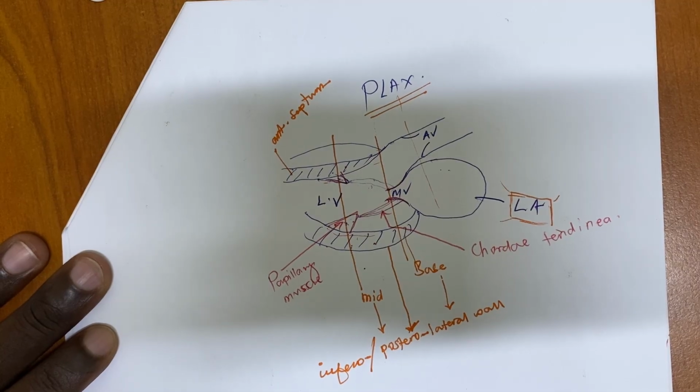Now, from short axis, we went to other views, and we see which walls of the left ventricle we see. Again, remember I told you we don't focus on the right ventricle because it's not all that important. This applies to only LV, maybe in some special conditions where it can act on RV, but not much.